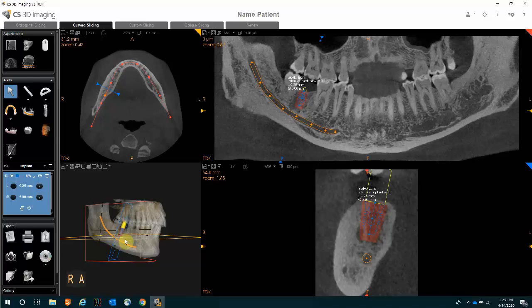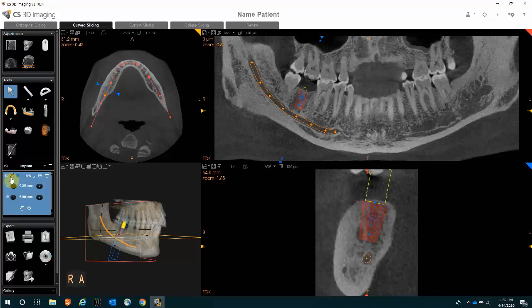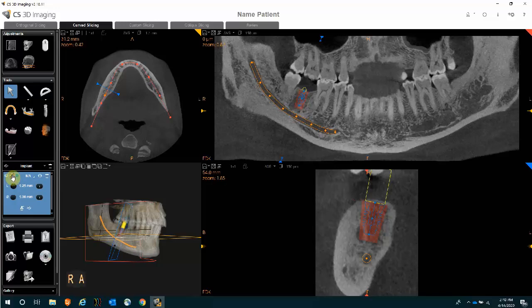You'll notice that the implant name and size are displayed next to it. It is strongly advisable to click and hold on that name and drag it to the side so it's not interfering with the rest of the anatomy. You can also hide the object properties on the left-hand side, meaning you won't display the size or brand of the implant. If you need to know what brand or size it is while the name is hidden, there is a pointer option that tells you exactly what size and brand of implant that is.